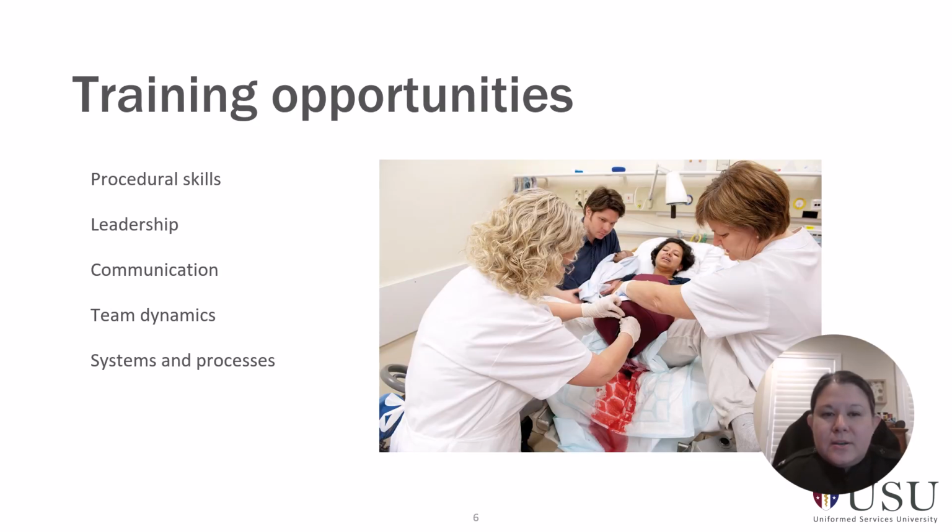So I think when you consider the different training opportunities that you're going to encounter, either as an educator or a clinician, you want to think about what you're trying to teach. Are you trying to teach procedural skills, in which case a task trainer may be adequate? Are you looking at things like leadership, how people lead a team, how they organize and how they lead under pressure or stress? Then you may have a different setup or a different plan in place.